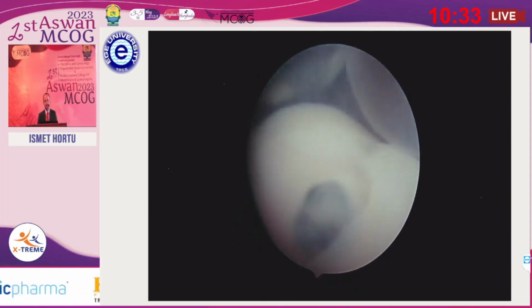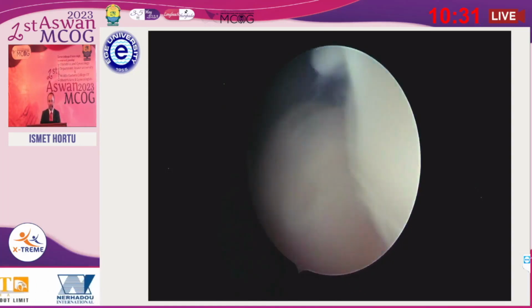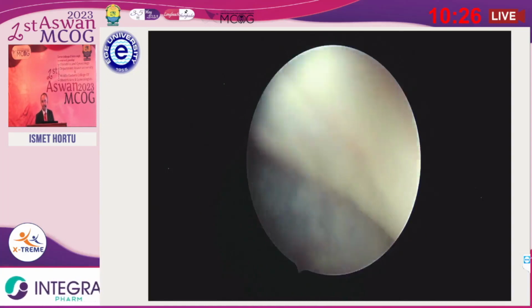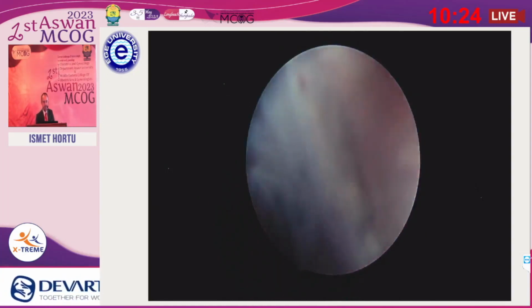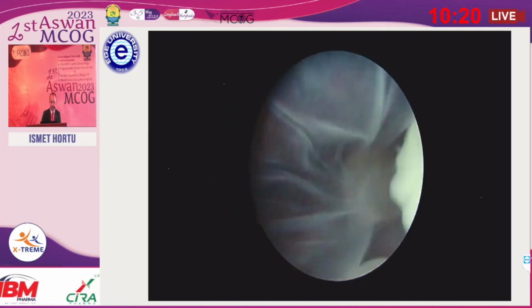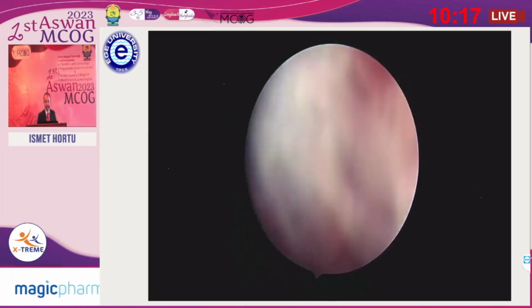But when we evacuate the uterine cavity by dilation and curettage or blind curettage, the maternal decidua comes with the samples and we send it to genetics. The genetics sometimes can be challenging and cannot be diagnosed.